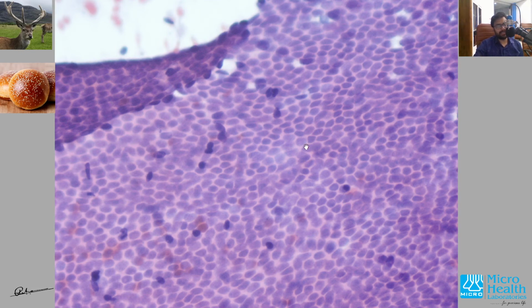So if you look here, all the cells are kind of uniform. So there is no pleomorphism, there is no mitosis that is visible anywhere. It's very much cohesive. There are no single cells out of the cluster. So that means it is benign, and fibroadenoma is a benign condition, and in a benign condition like fibroadenoma, the cells are cohesive clusters and sheets, very much uniform, bland nucleus. There is no pleomorphism, nothing. There is no big mitosis around to be seen.